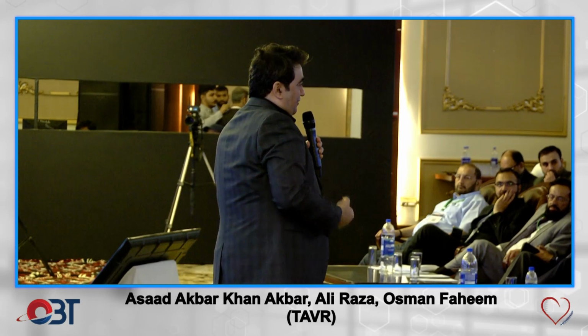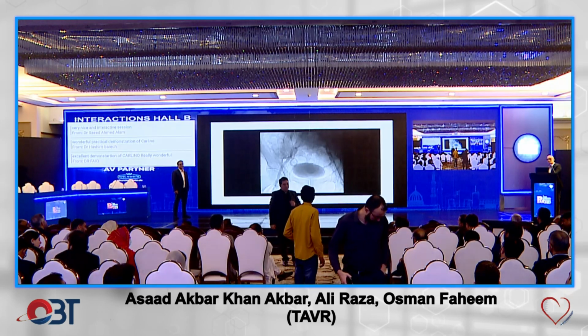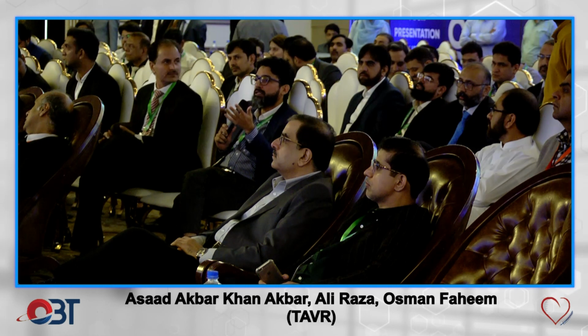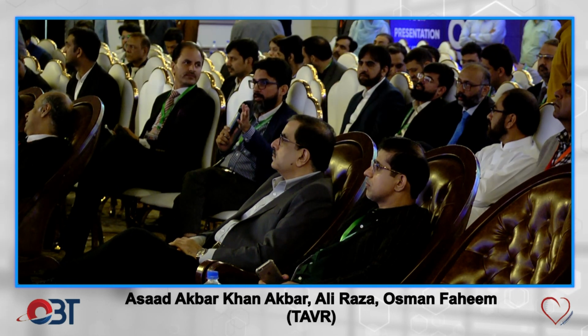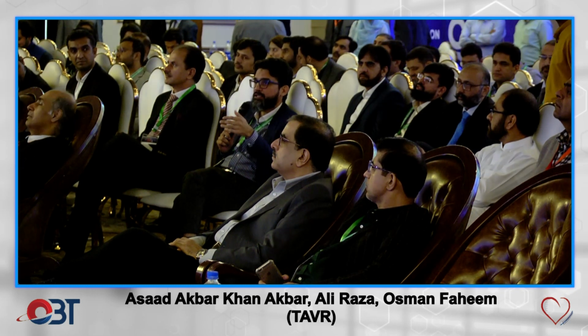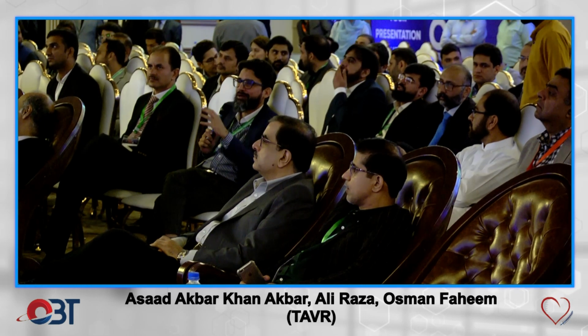No, see, Ali, the issue is this. I recently had a case just last week. BAV, we did BAV, and the patient goes into wide open AI. He opens his mouth, he gets intubated, and then we literally deployed the valve in a matter of seconds. You don't have time because this patient's lungs are drowned now. The enfolding doesn't matter.